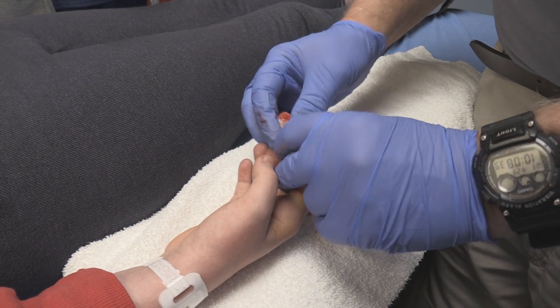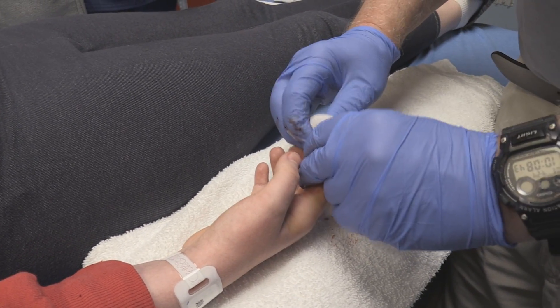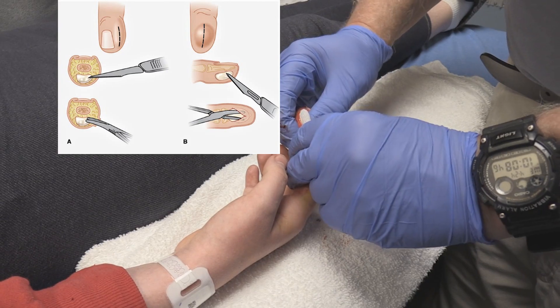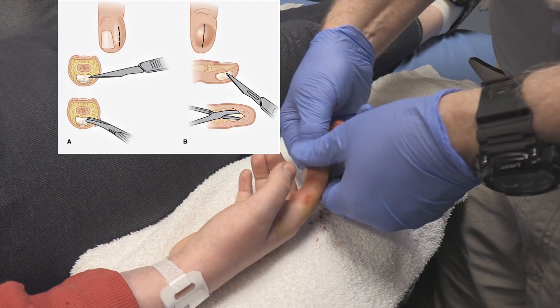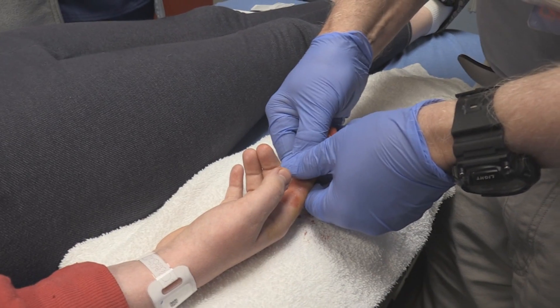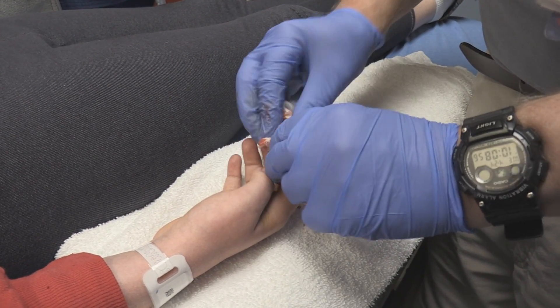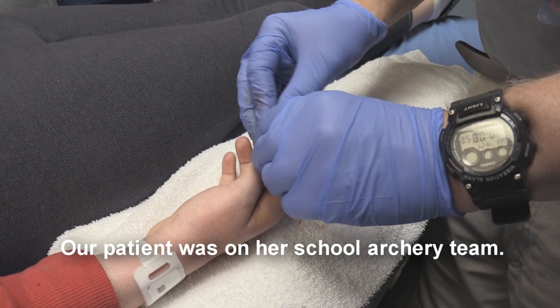Now, the other option is to do an incision in this — not major, that's hyperbole — but it always leaves a scar. It sometimes interferes with the function of the finger pad. And I find that... she shoots archery, we can't do that.